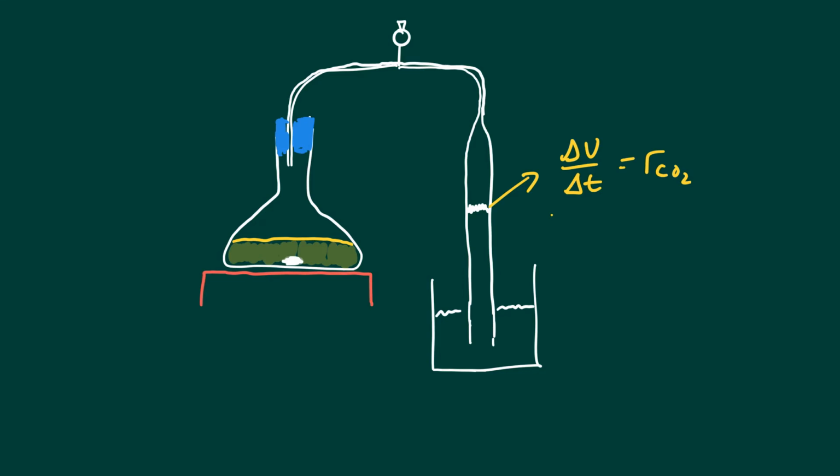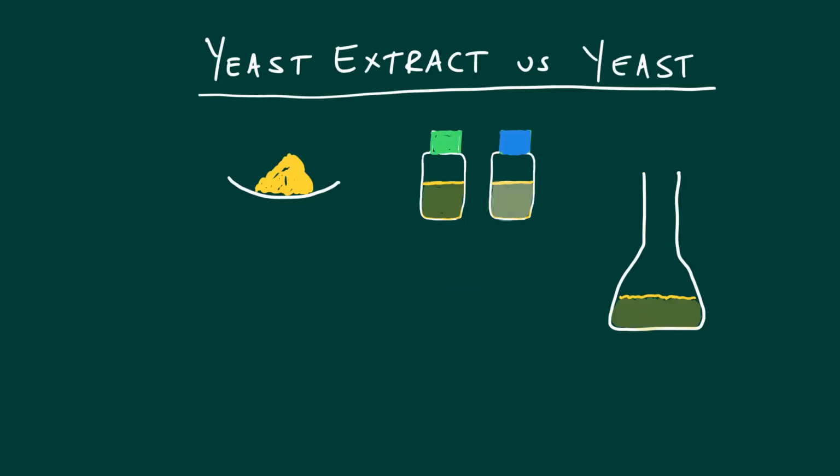So just before we get on the measurements, please note there's a difference between yeast extract and yeast. So the yeast extract is that yellow powder that you're going to prepare. Some of you, those doing maintenance experiments, won't be having this yellow powder, because it's not alive. It is derived from dead yeast cells, but it is what we had in CBI, effectively you can say your nitrogen source. It's not ammonia, it's a complex nitrogen containing molecules, but it's really what the organism requires to grow. Okay, please don't confuse that with the yeast itself.